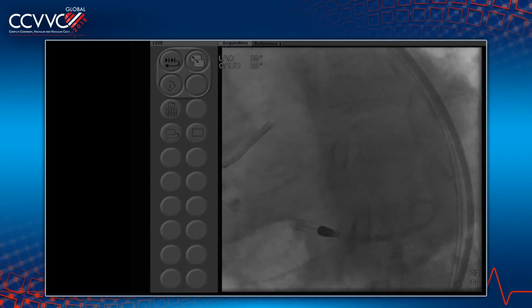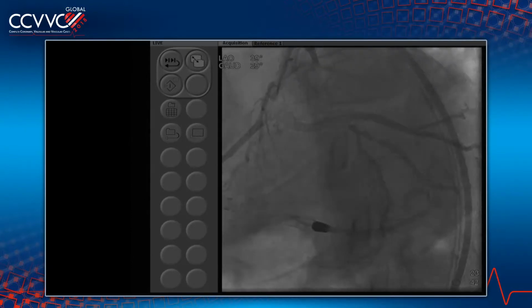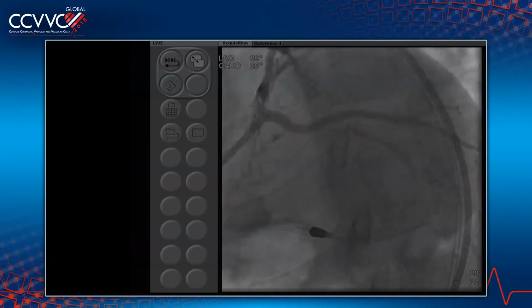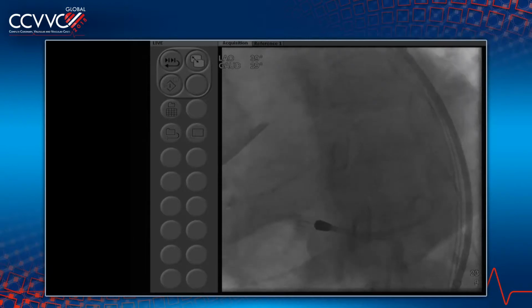I think very important, I see the Impella guidance. I know you don't want to spend too much time because we've got a lot of other cases going, but we have John LaSala. Anyone here would actually attempt this kind of a case without support? Paul, would you do this without support? Paul is questionable about the support, but the majority here would say that support is definitive. It looks like you just did a single stent technique.